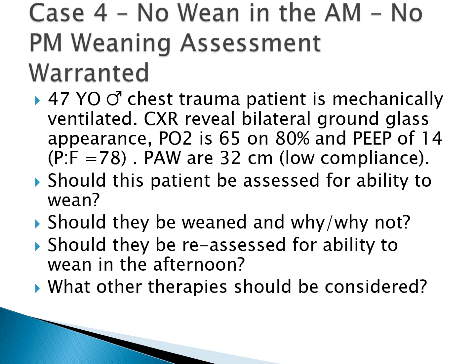Continue liberal use of PEEP, but with low tidal volume approaches. You also want to see if there's something else going on with this patient, if they could benefit from mucolytics, CPT, recruitment maneuvers, and things along those lines. These patients tend not to be great candidates for recruitment maneuvers because they have low compliance. It's not that they have atelectasis per se, but their lungs have excessive fluid in them, they're wet, they're stiff, and hopefully we can reverse this over time with the patient's own constitution and our care of them.